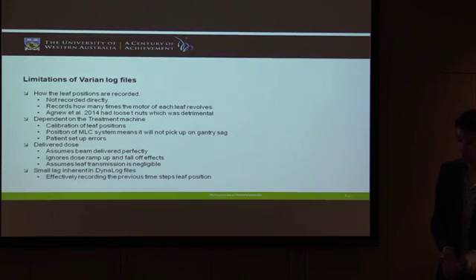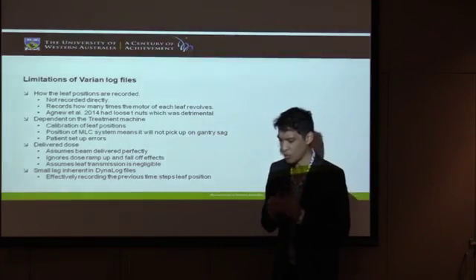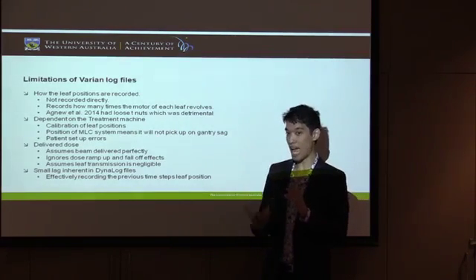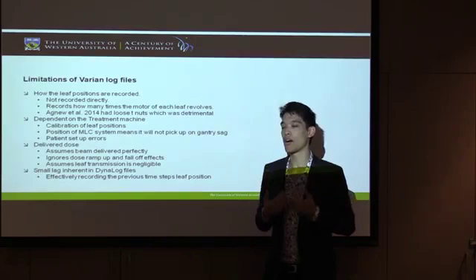There's also a small lag inherent in the Dynalog files. There's a small 50-millisecond lag in the actual system. And what that means is basically when it records the actual positions of the leaves, it records them in the time step after.